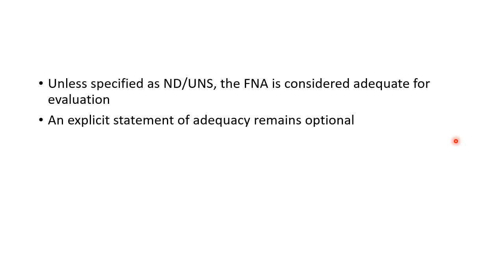So unless specified as non-diagnostic or unsatisfactory, FNA is considered adequate for evaluation. For the non-diagnostic category, we have to mention non-diagnostic. For the other categories, we do not compulsorily have to mention that the FNA is diagnostic. Suppose for category 2, we do not need to mention that the FNA is satisfactory because we have not specified it as non-diagnostic. So if you do not call it non-diagnostic, it automatically means that it is diagnostic. An explicit statement of adequacy remains optional.